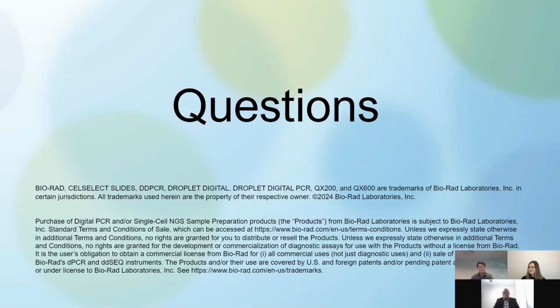Yes, thank you, Kayla, for that question, and whoever is asking that question in the audience. So it has serious clinical implications in the sense that EGFR mutations in ctDNA are a common biomarker in NSCLC diagnostics, and the presence or absence can shape the treatment strategies for lung cancers and influence patient prognosis. Additionally, analyzing CTCs from the same sample can shed light on functional cancer studies and drug susceptibility assays. So that's almost like having a double whammy where you're analyzing 2 different things from the same sample. That's the import of the clinical significance of that.